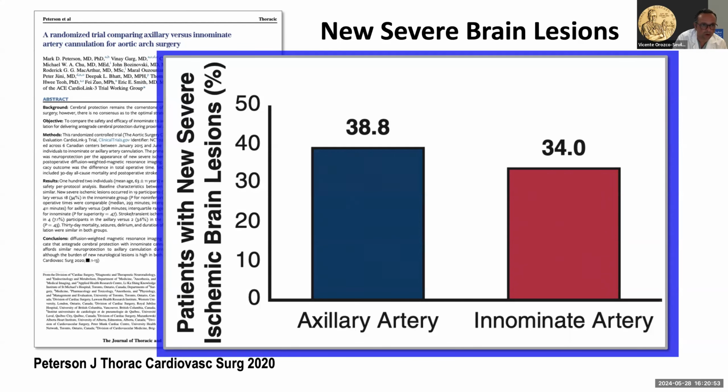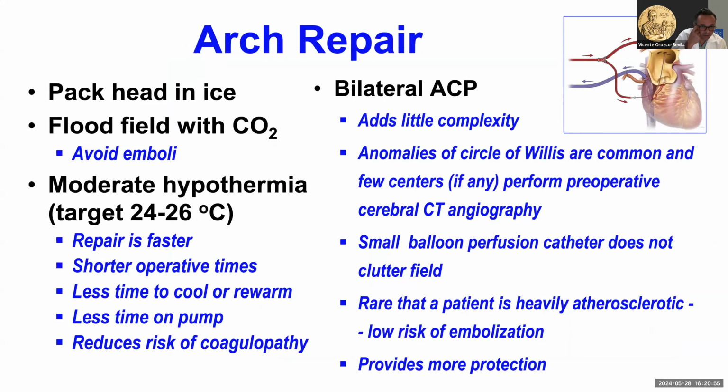So this is important to know. What about the arch repair? This is what we prefer to do in the OR. We always pack the head in ice. We flood the field with CO2. This is to avoid some gas emboli.